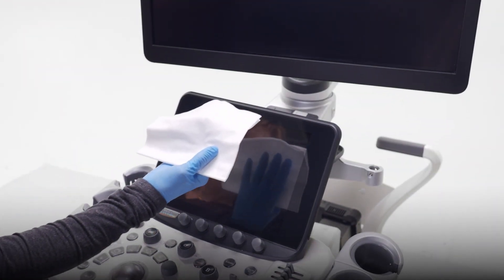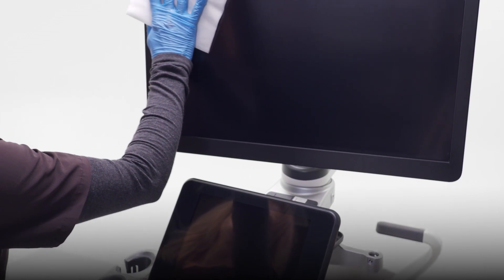Finally, use a soft lint-free cloth to gently wipe away any remaining moisture.